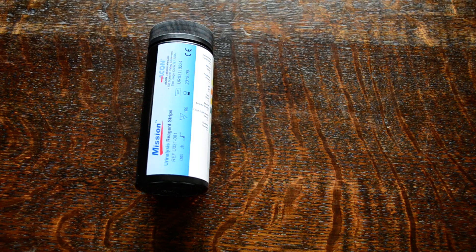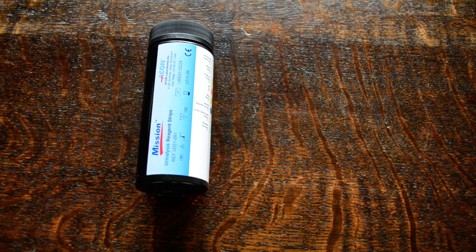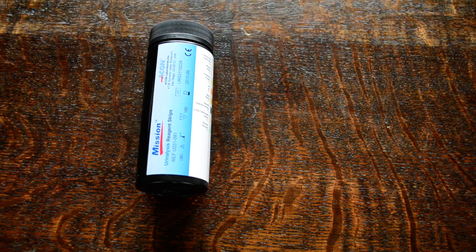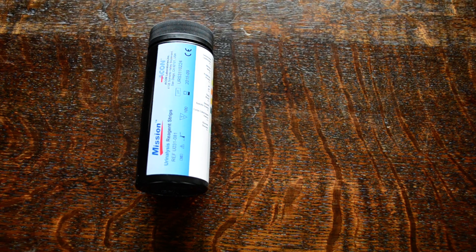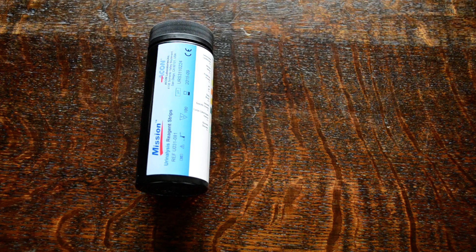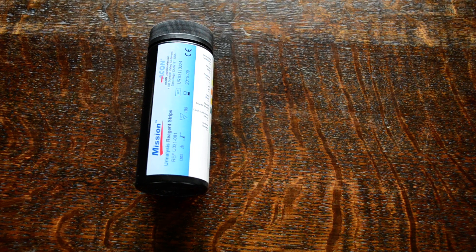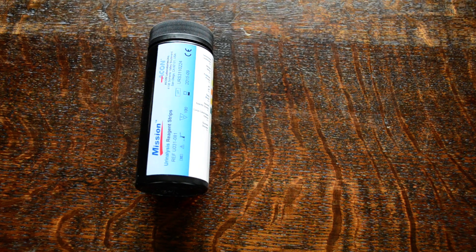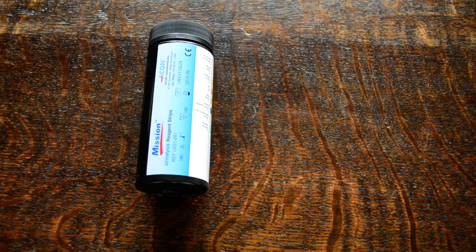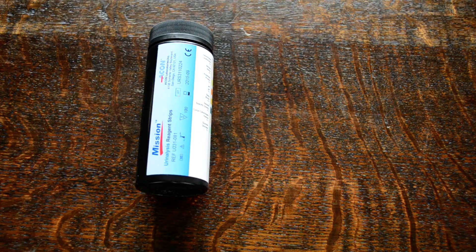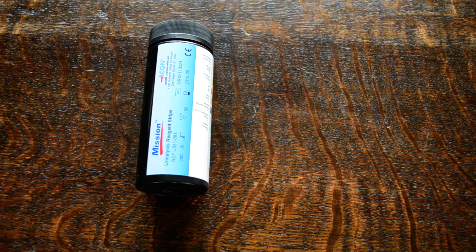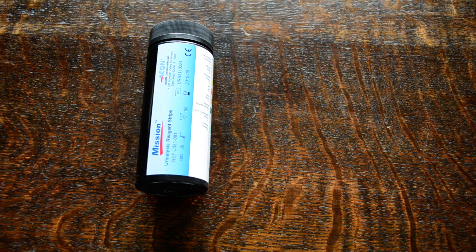Hi and welcome to this demonstration video. We're going to show you a test strip that is used universally for screening for cystitis or kidney infection.